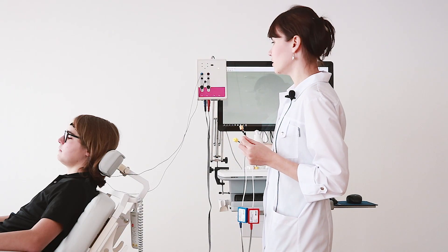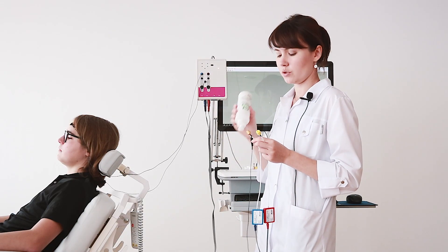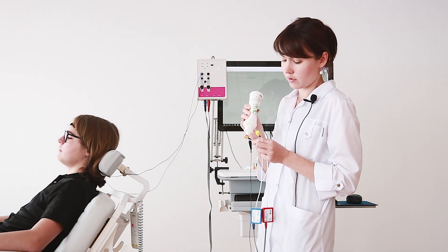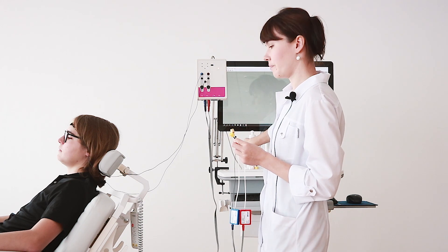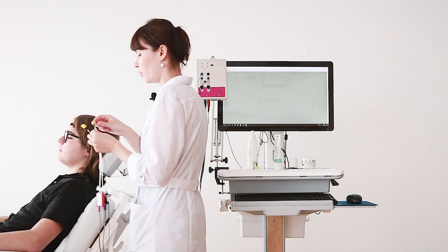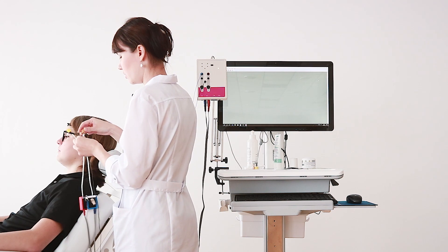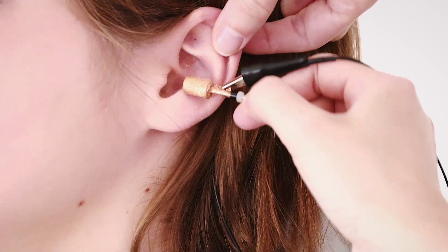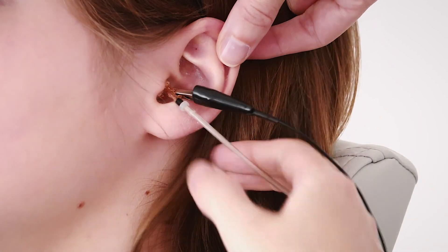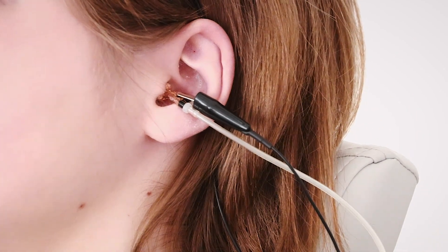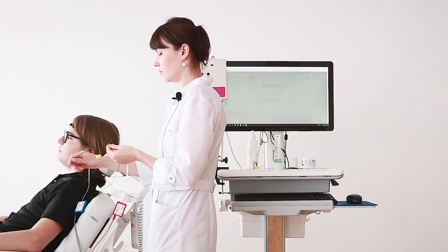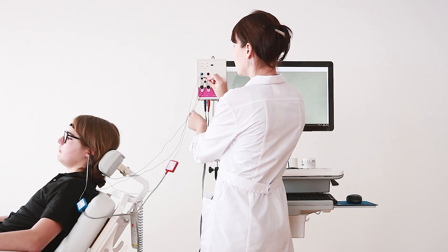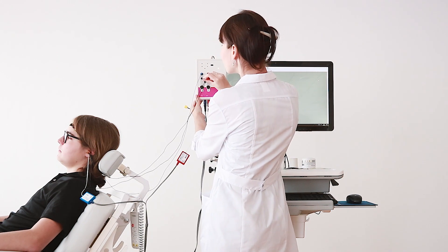Before inserting in the patient's ear, we need to apply a small amount of conductive gel on the tip-trode. Now we prepare the tip-trode this way and insert it in the patient's outer ear canal as deep as we can. Now we connect our tip-trode to the amplifier using the plus third channel.